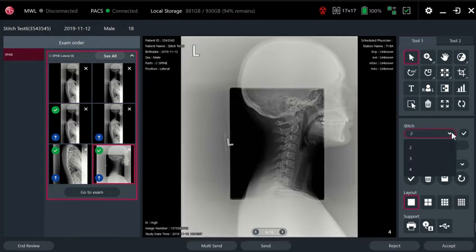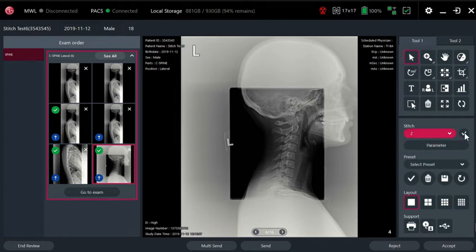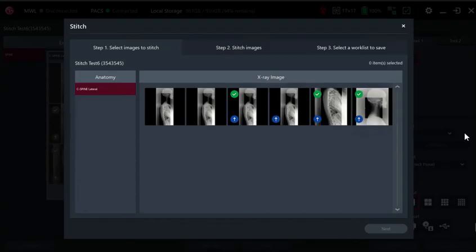You can stitch up to four images. We're going to just do two here and then we click to check. The next screen opens up and here's where we select the images that we want to stitch together.